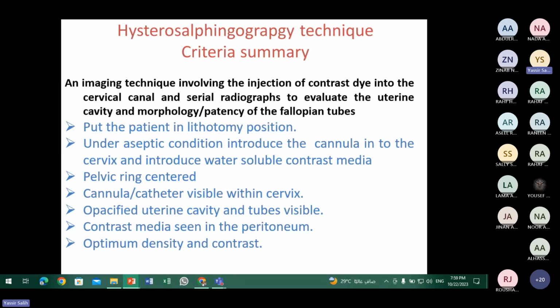Why the abdominal cavity? You are right, but why? Because the fallopian tube or uterine tube is freely open, not blind. يعني distal part بتاعتها تكون freely open, not connected to others. So the contrast then passes freely into the peritoneal cavity.